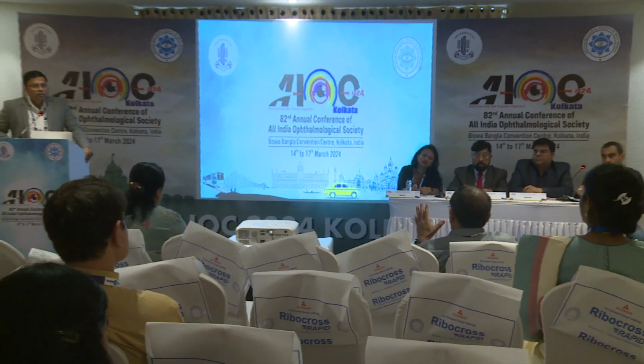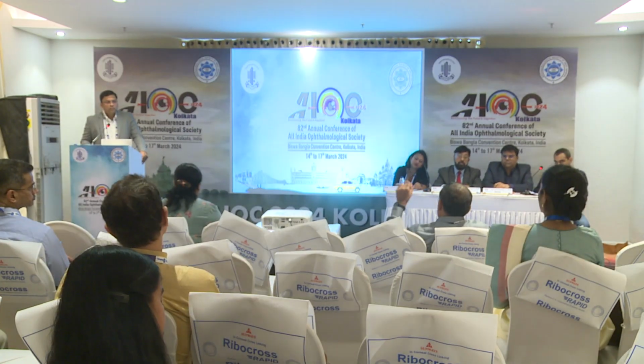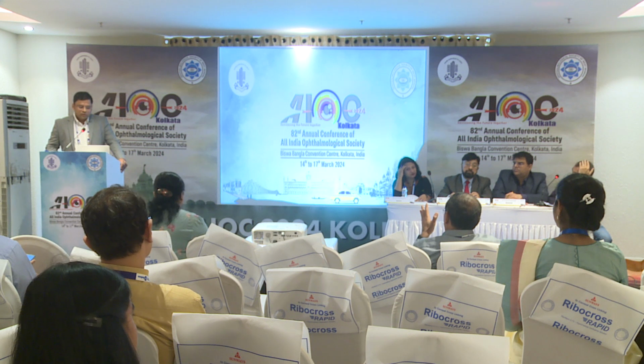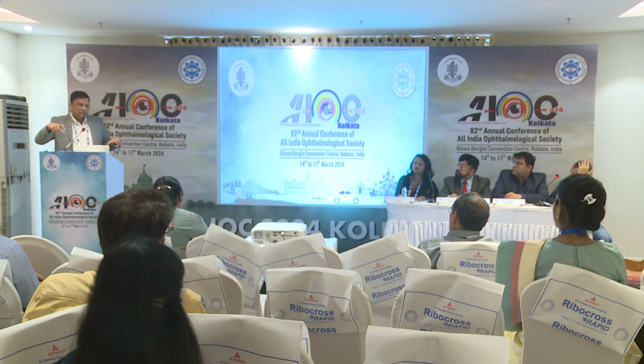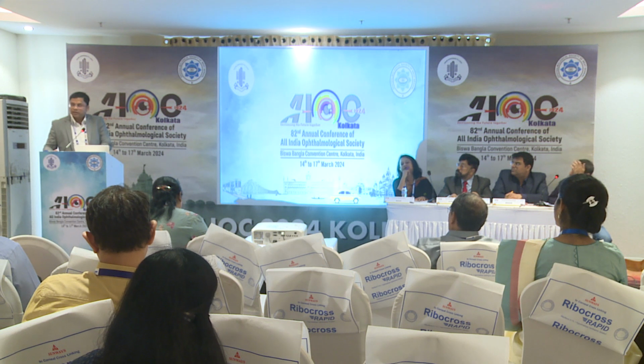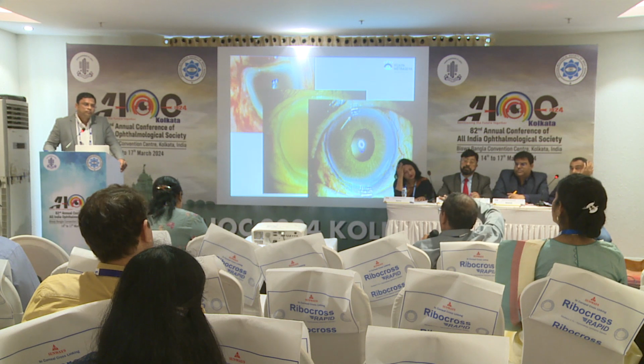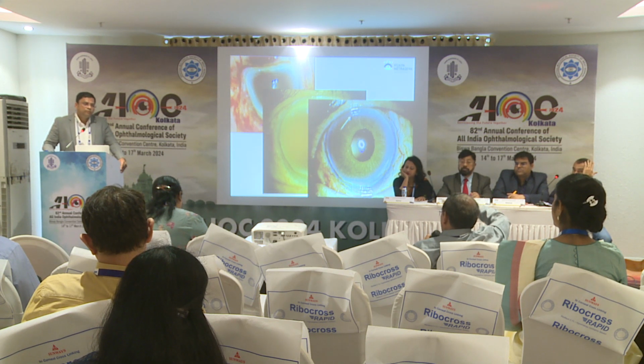Dr. Anand, what about the stability of this artificial iris? You are only hitching at 2 places. Yes, sir. So how does it actually get that typical iris stability? Because it can be floppy, it can swirl around. So, sir, actually, the iris is also fixated at 4 points, 2 points each. 4 points. Other than that, you're actually stitching the IOL also. Yes, sir. In another 4 points. Another 4 points. 4 different points, that's right.